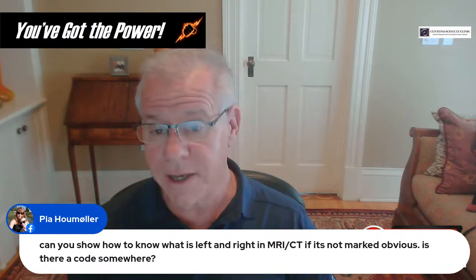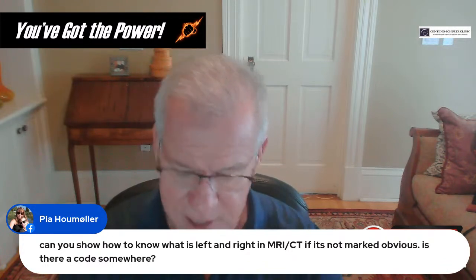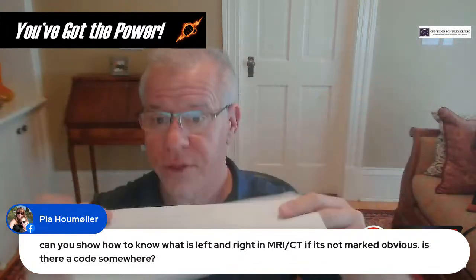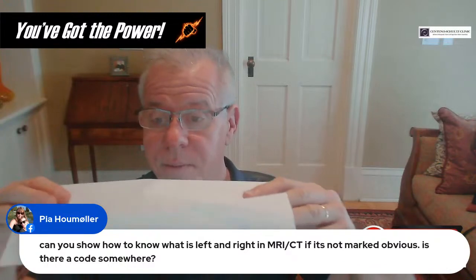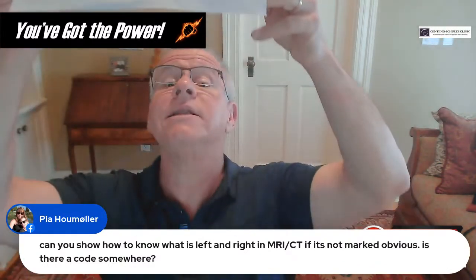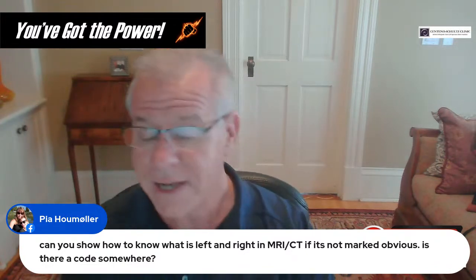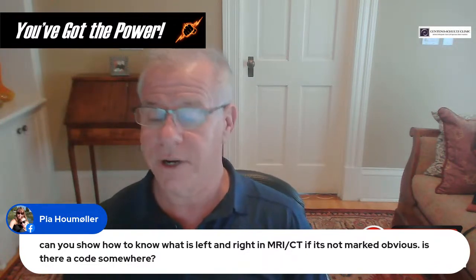The reason is that they chose to do a slice through the person, but they're looking up at the slice. So it makes sense if you think of it that way, where it's opposite.